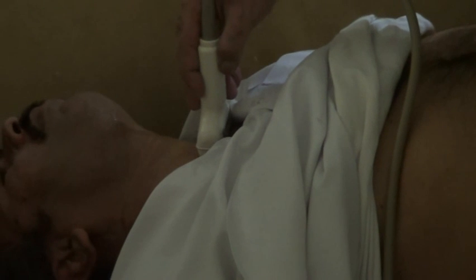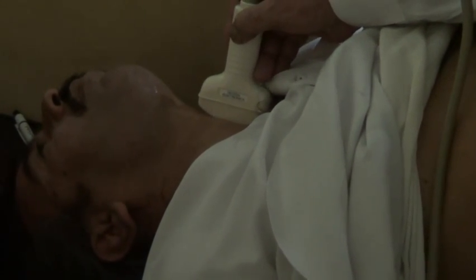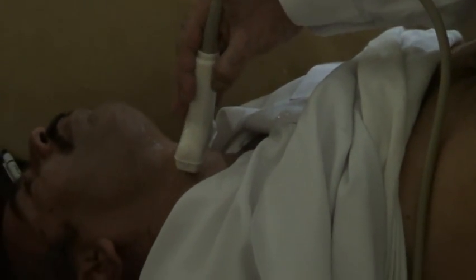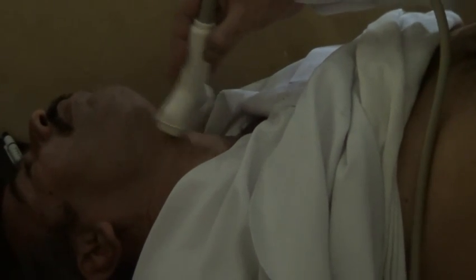In this way I will move the probe in this direction and then 90 degrees from here in this direction, and then 90 degrees in this direction to get the thyroid gland in longitudinal section. This will give me the transverse section, this approach, just at the trachea.